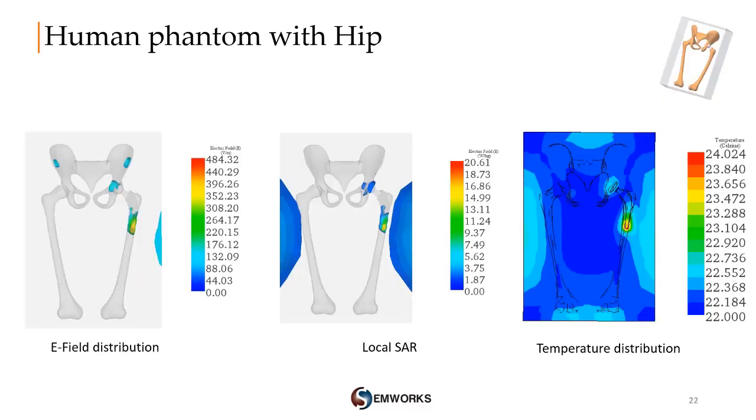A first run is done using the rectangular phantom with skeleton geometry as shown. We got the following results. The maximum electric field is localized around the implant bottom point with a value around 450 volts per meter, and the local SAR follows the same concentration points to achieve a value of 20 watts per kilogram, which is lower compared to the ASTM phantom. An increase of 2 degrees Celsius is obtained in the bone tissue.